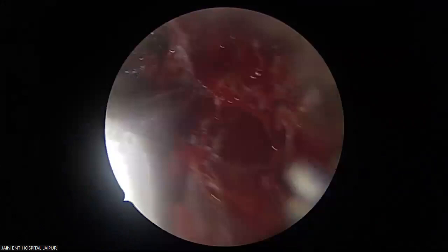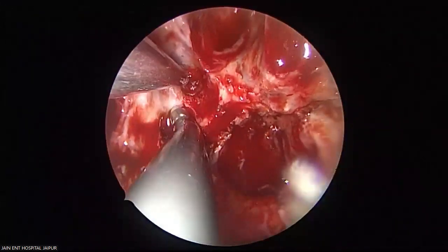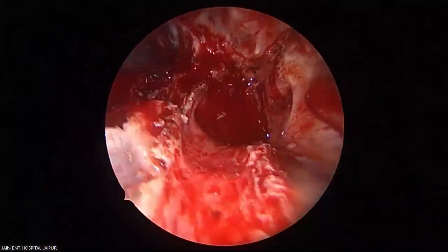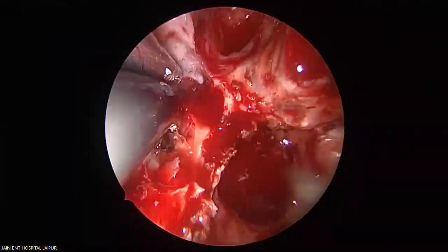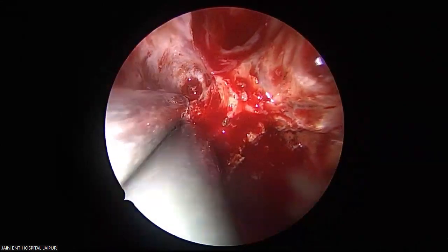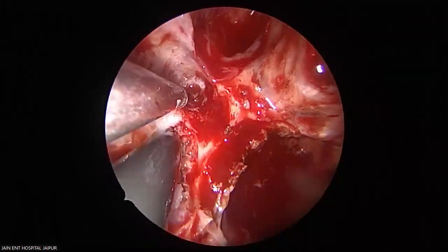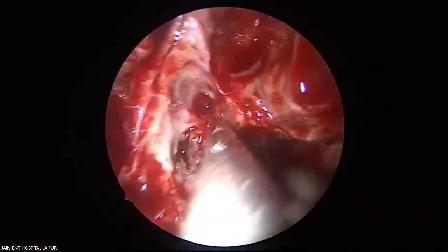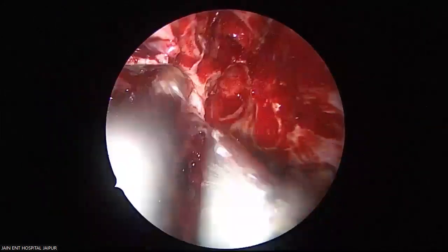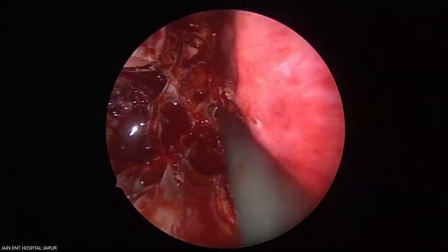This is all venous bleeding, healthy bleeding. See, this is the pterygoid fossa from below. Now I will show you all this anatomy in one go.